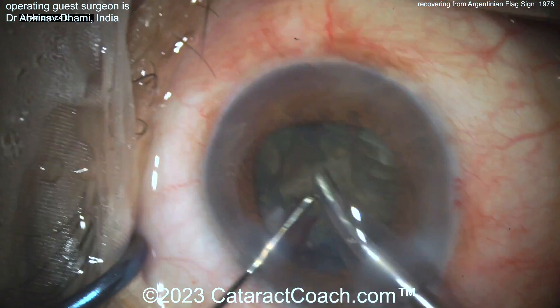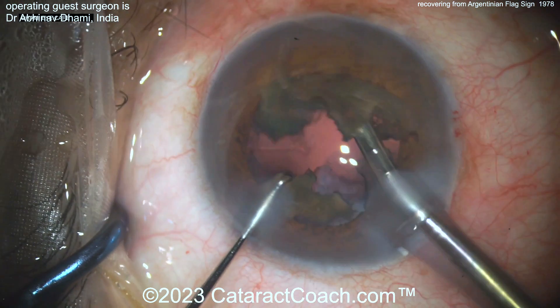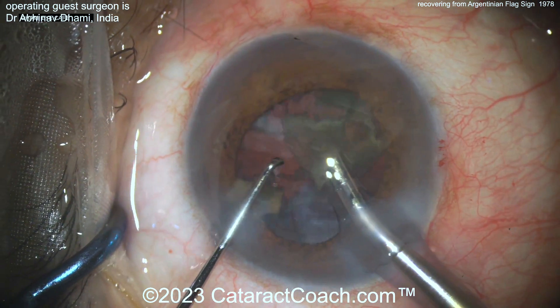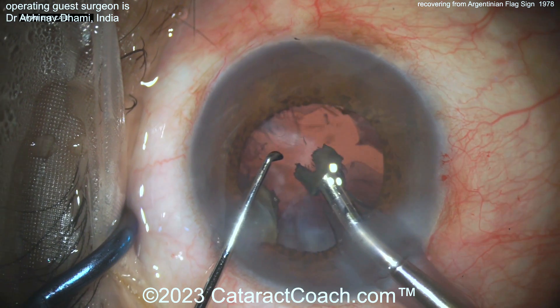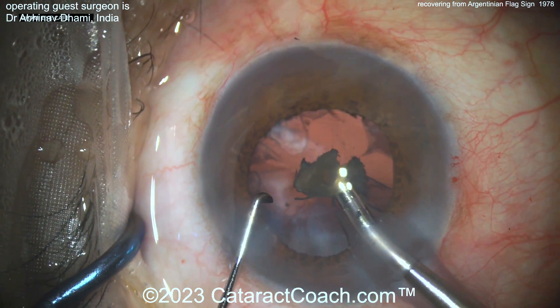This is stressful. Now you've learned your lesson — you know what to do. Do not tempt fate. If you have a pressurized lens like that, you have to do something about it. Watch the cataract videos: baby rhexis, double-rhexis technique, needle decompression, FACO probe decompression — whatever you want to do, do something.